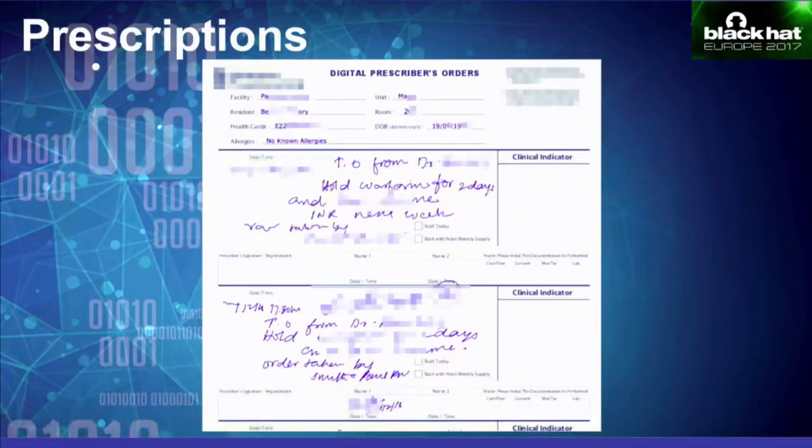But since we went directly to the database using these credentials and completely bypassed the presentation layer, which is the portal and might have some segregation, now you're directly on the back end and can pull out all this data. We were able to view data from all the medical institutions and healthcare institutions where this pen was deployed, not just where our test pen was deployed. So that was tons of medical data.